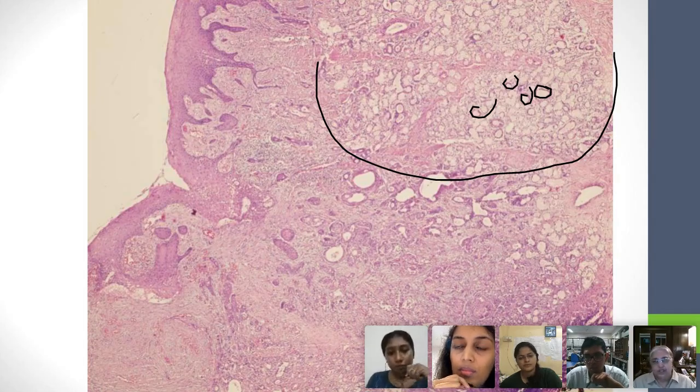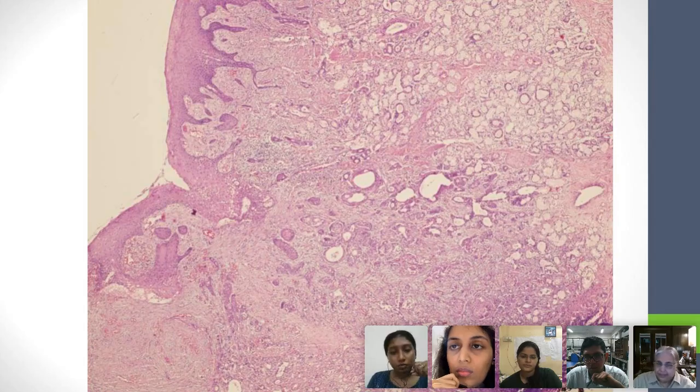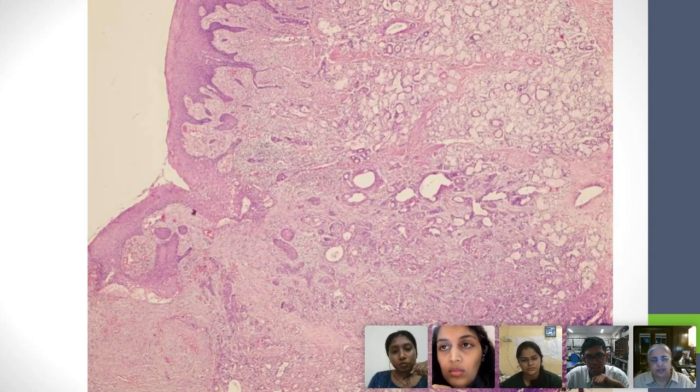So now, Ashish, you want to go back and say what you think these things are. Duct-like proliferation. They are ducts. And you can see not only are they ducts, but they're branching, right? Yes, ma'am. There are duct-like structures, ducts and ductules. You want to call them ductular, whatever, but they are branching over here. It's interesting, isn't it?